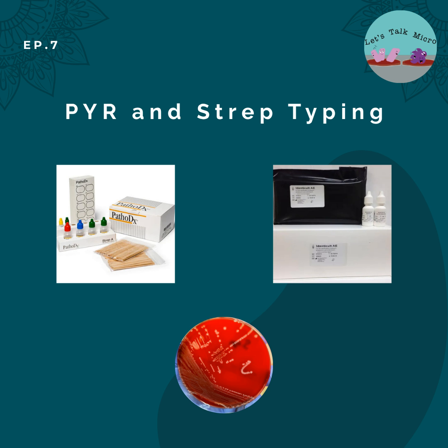Okay, so now let's talk about strep typing. Strep typing is based on the Lancefield group. This test is used for beta hemolytic strep. Some species of beta hemolytic strep have a carbohydrate on their cell wall. Getting technical, the reagent in the kit reacts with the carbohydrate on that cell wall, producing agglutination. And the Lancefield system classifies the bacteria in groups.